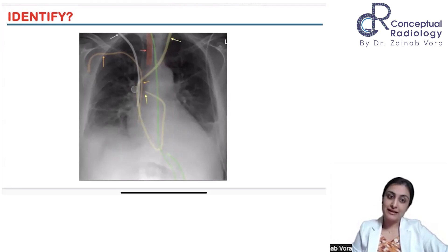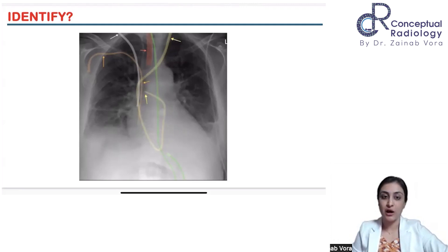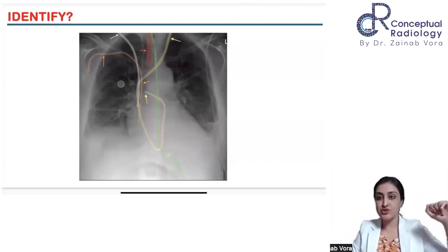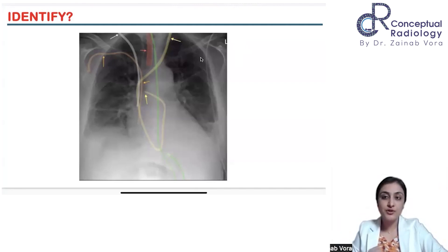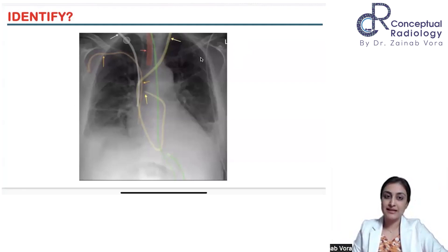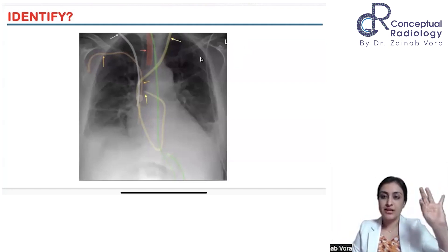The yellow line is a Swan-Ganz or pulmonary arterial catheter. It is placed from the brachiocephalic, going into the right atrium, then right ventricle, up through the right ventricular outflow tract, and into the pulmonary artery. It should be positioned around 2 centimeters from the hilum. If it impinges too much into the hilum, there is a risk of pulmonary arterial injury. The white line is the central line — inserted along the right subclavian — with the tip near the SVC-RA junction.